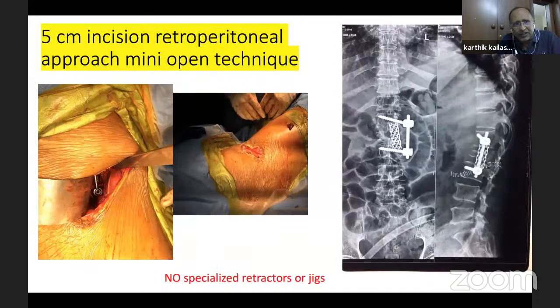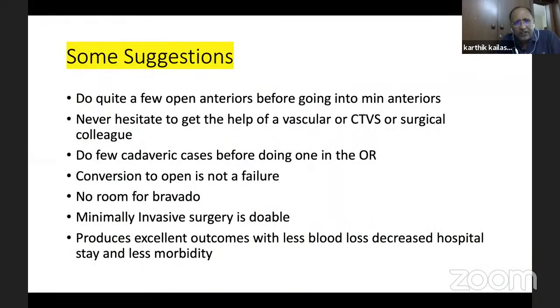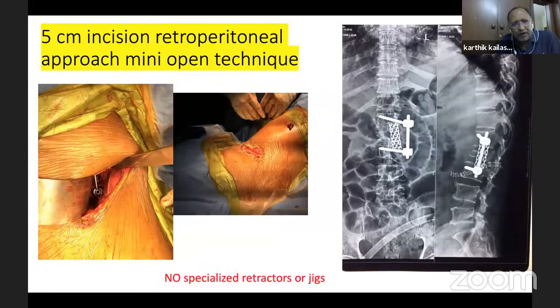Through a 5 centimeter incision retroperitoneal approach, we just used regular Hohmann retractors. Place the Hohmann retractor posteriorly at the pedicle and the foramen junction, and then used a deaver as well as a small retractor, and we could go ahead and do a complete corpectomy as well as a cage fixation. The idea was that this is a repeatable procedure done in any government hospital or any institute, and we do not need specialized retractors or specialized jigs. The same 5 centimeter incision which people talk about, we do the same thing.